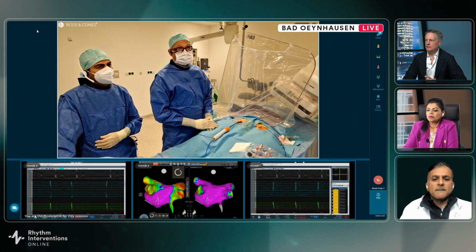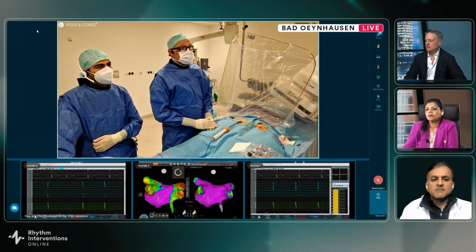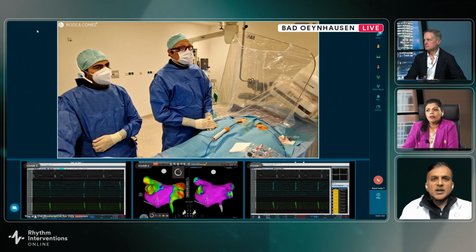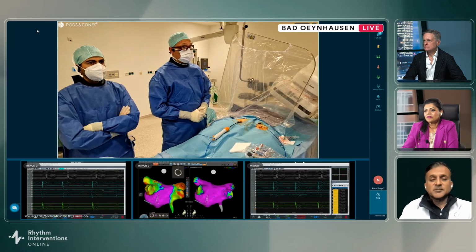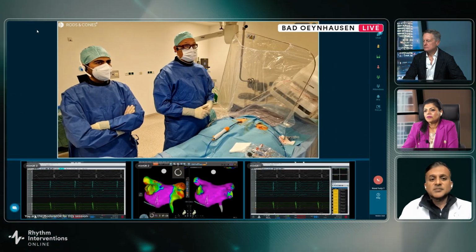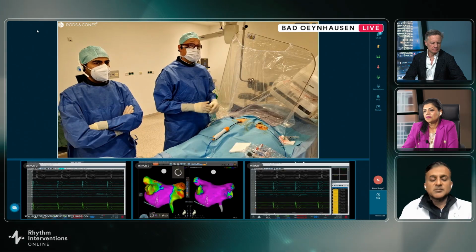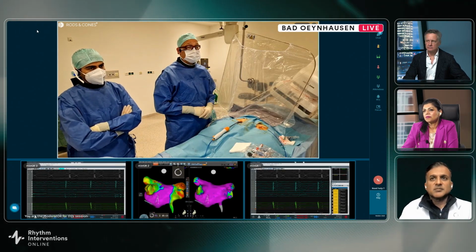And have any of you experienced phrenic nerve damage associated with this technology? I have not. We have not observed it so far, no. But I mean, there could be some. If we discuss indeed vena cava superior isolation or something like that, we need to be aware of that.